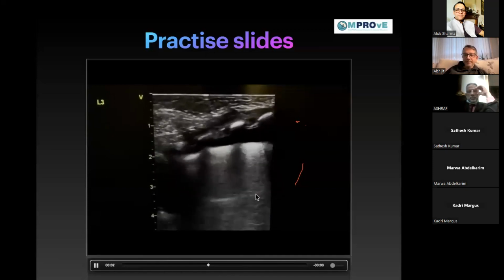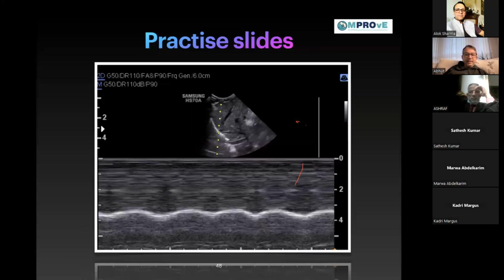It's okay. Thank you. Yeah. Lovely. Could I ask you? Yes. Tell me, please, in your practice, if you see a pleural effusion, do you have some criteria for pleural puncture? And if you have these criteria, where do you measure?